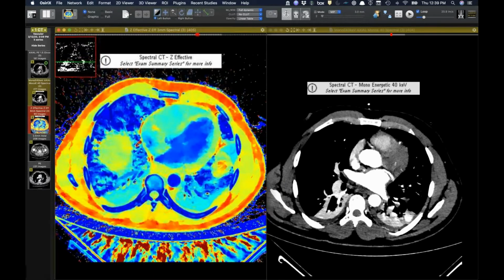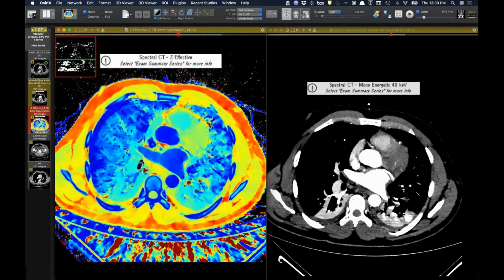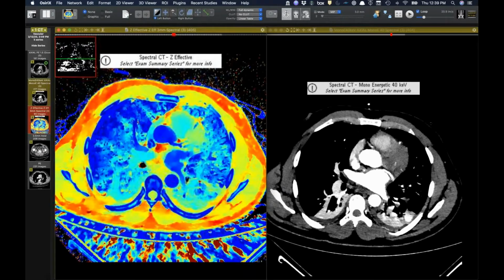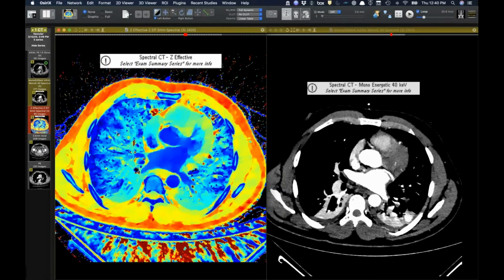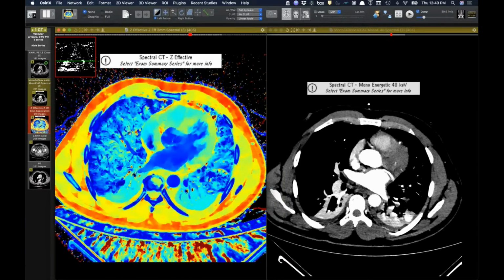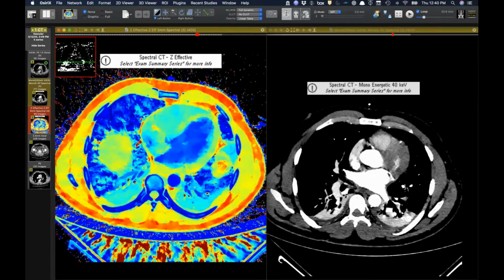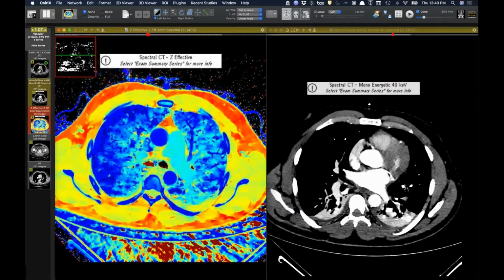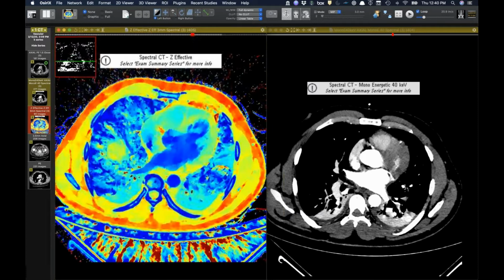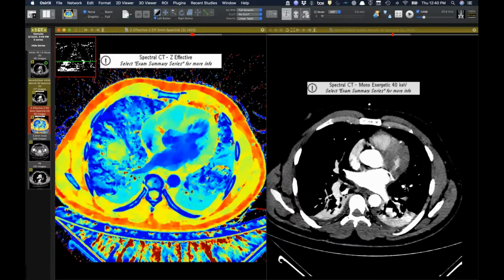I don't. So go up higher. So it was right. What was it? Right middle lobe. It was medial segment, so it should be. Well, I don't know. So is that normal middle lobe perfusion? It seems to be. It's a little less, but it's kind of similar to the lingula there. I don't know. By the diaphragm, it gets tricky.